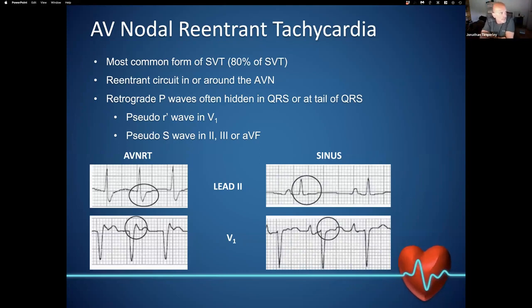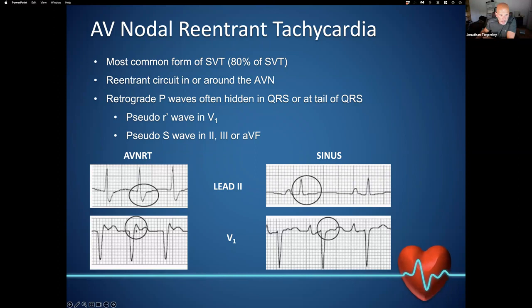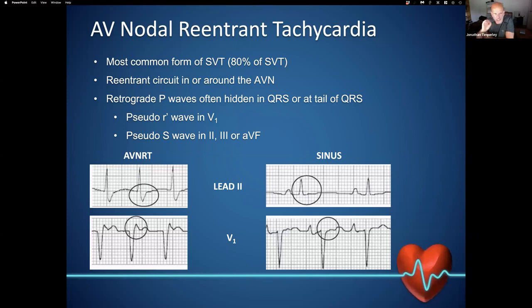AV nodal re-entrant tachycardia is the most common form of SVT. This involves a re-entrant circuit in or around the AV node. You can often end up with a retrograde P wave that's visible or hidden in the tail of the QRS. This can lead to what's called a pseudo-R wave in V1 or a pseudo-S wave in the inferior leads. Looking at this patient who has a sinus beat, in lead two and V1, when they go into an SVT we end up with a retrograde P wave on the tail of the QRS — simulating a pseudo-R wave in V1, while in lead two an S wave appears that was not present beforehand.